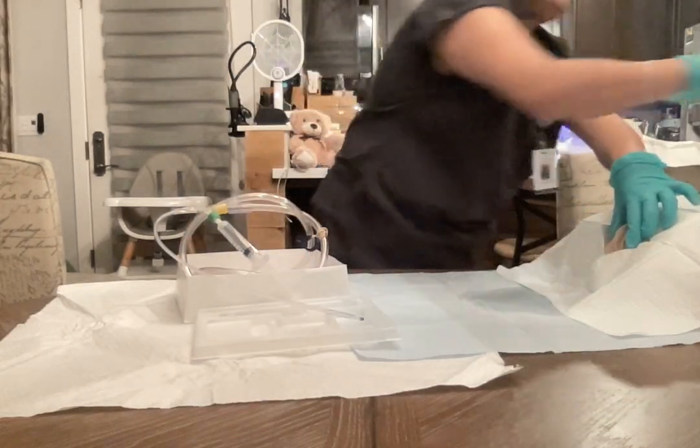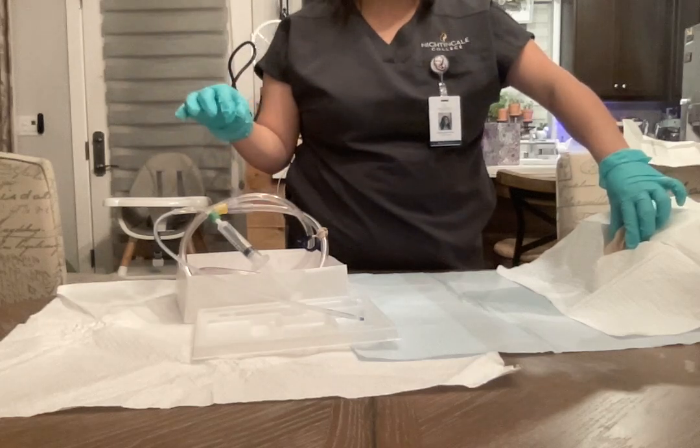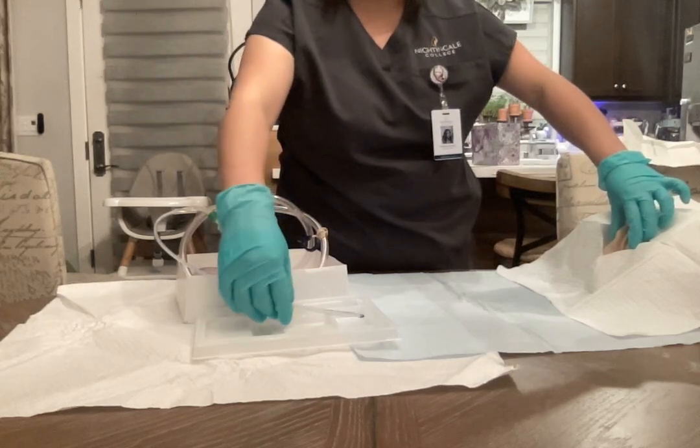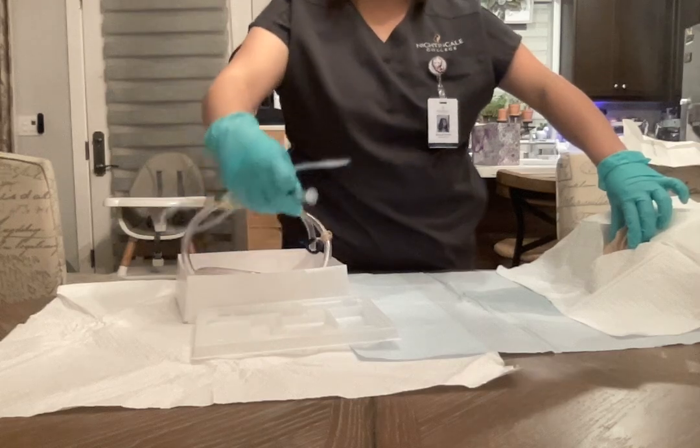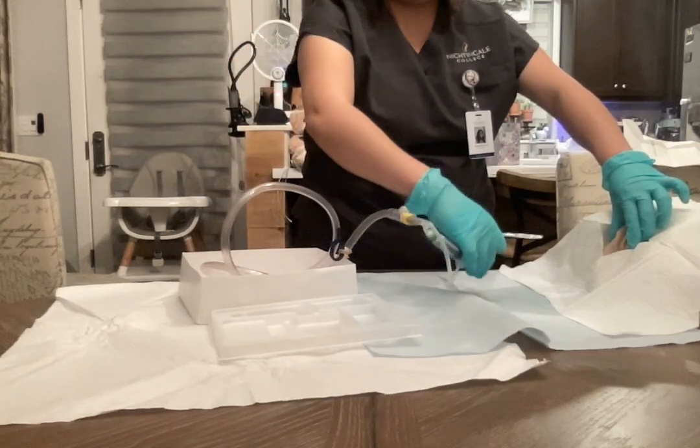Okay, and then place used swabs in the trash. Grasp catheter 2 to 3 inches from tip. And then insert as patient exhales, and then advancing until urine flows.